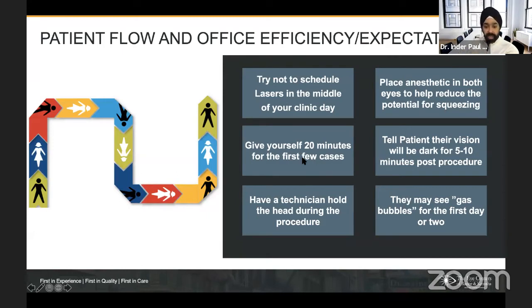a little bit better. Another question here is, what is the clinical difference of 1 pulse per shot and 3 pulses per shot, given the total energy is the same? Well, the total energy is higher per shot because you have 3, but yes, you're going to have the total energy you want. My advice is, if you have a solitary Weiss ring, I use 1 pulse per shot. I go very fast. You can fire 3 shots per second with this laser. So in other words, there's no way you can fire fast enough. So I go very quickly with 1 burst.